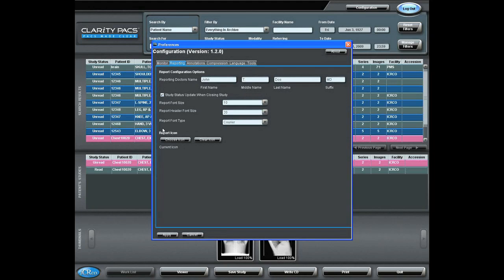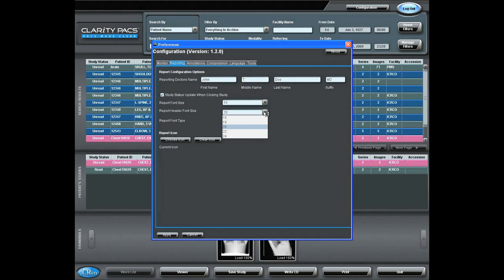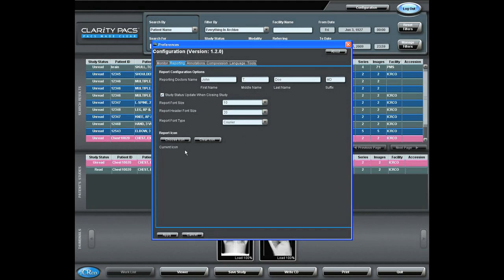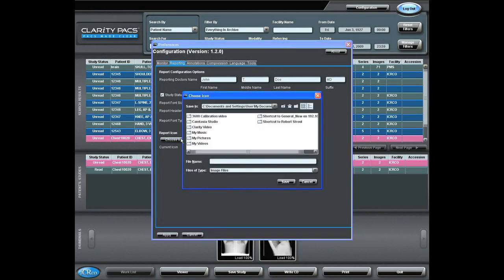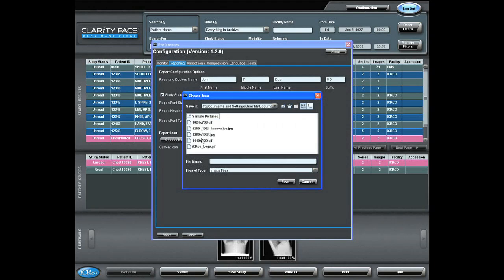And from here, I will choose, if I so desire, the size of font for the body of the report, the size of the font for the header of the report, the face of the font for the report, and an icon, if I so choose, of my practice or my facility for the logo of my report.